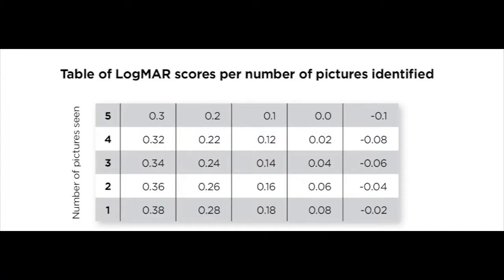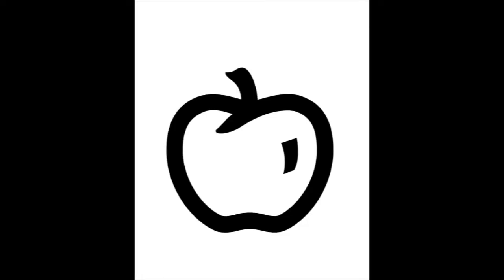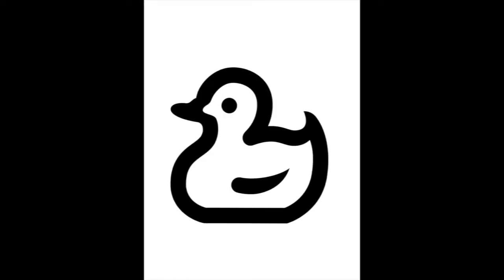When you come to test the other eye, choose a different set of pictures to avoid the child remembering. You can refer to the chart on the inside of the back cover for a per picture measurement if using the linear crowded option. There's a choice of 3 uncrowded pictures and 2 different crowded options at each acuity size.